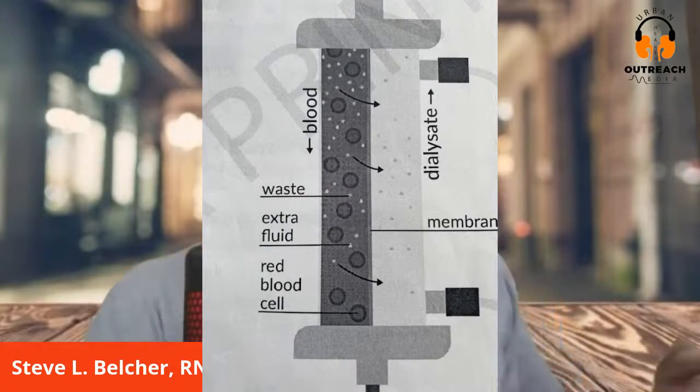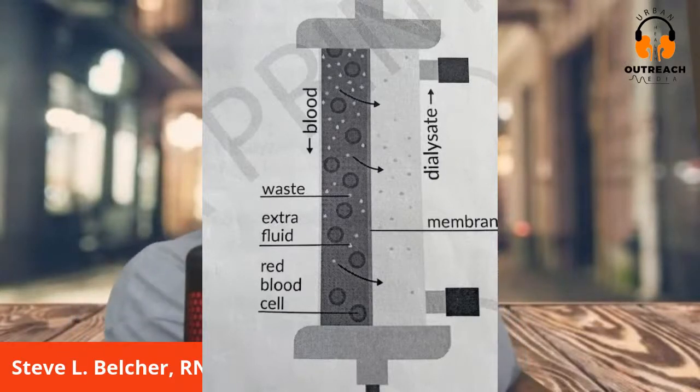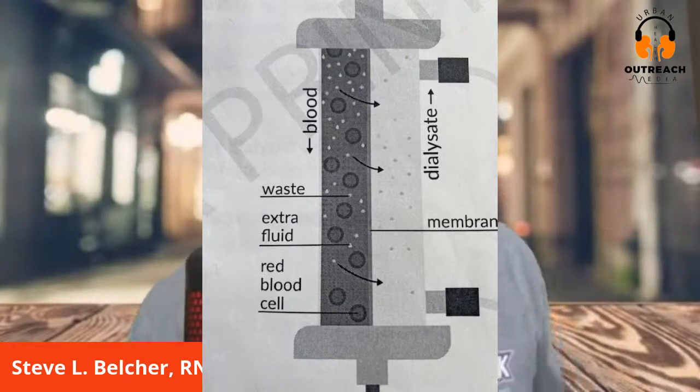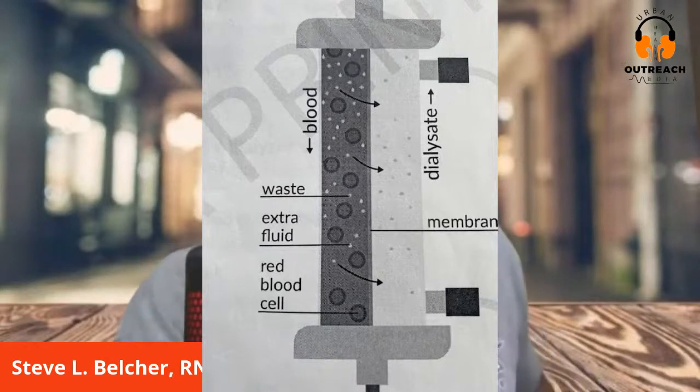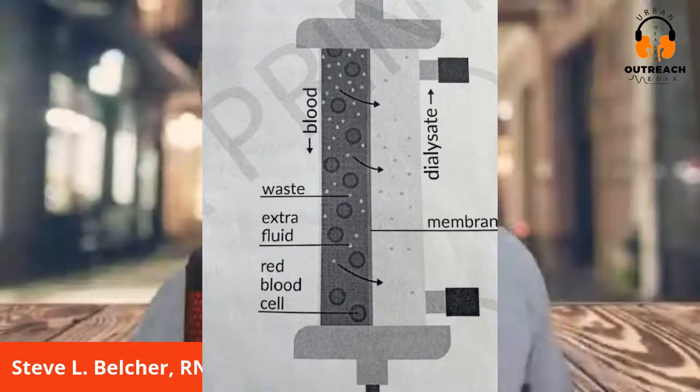The dialysate pulls, okay? It pulls waste. Again, dialysate pulls waste because of the dextrose and the other stuff. Remember I told you osmosis and diffusion. The dialysate with the waste is flushed down the drain and the clean blood goes back to you. Extra fluid in the blood is removed in a similar way.